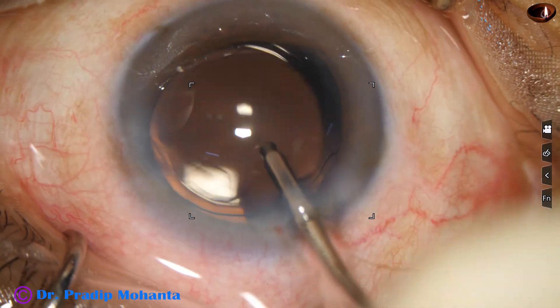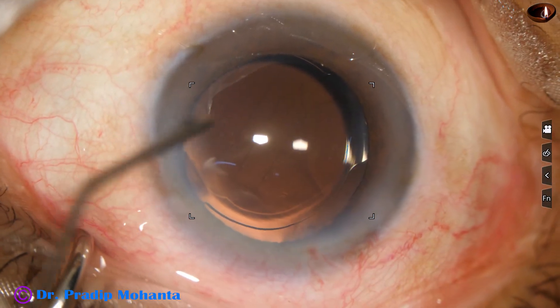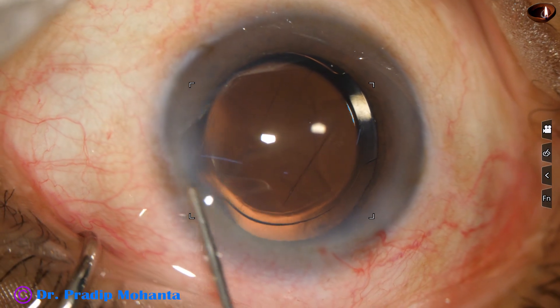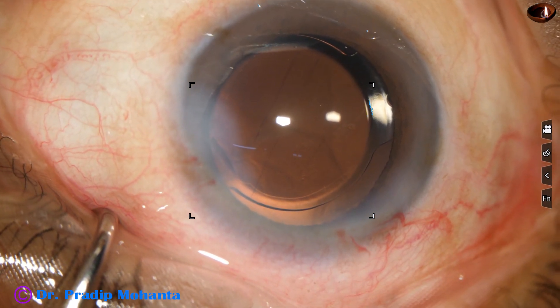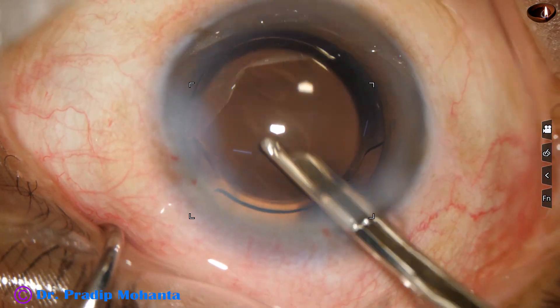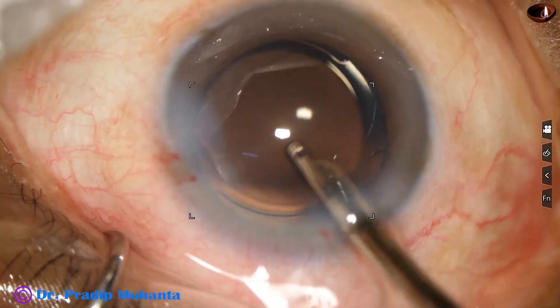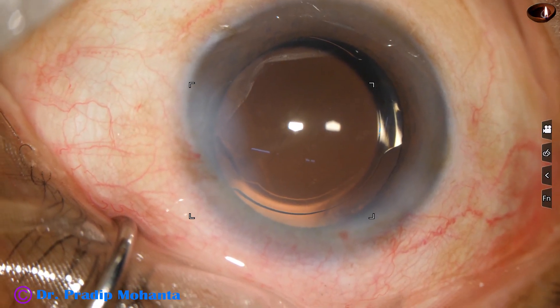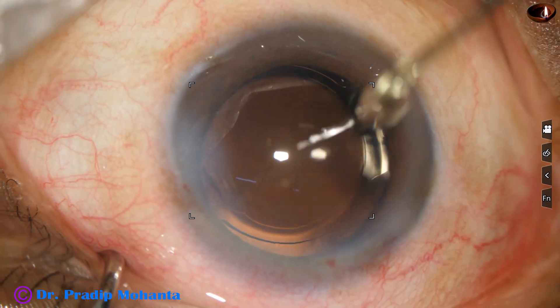And we are towards the end of the surgery. This is a totally un-edited recording, and this very hard cataract has been managed in less than 7 minutes. But we don't have to hurry up — if it comes naturally then it is okay; otherwise we can take our time with such cases. This is the final lavage of the anterior chamber. The anterior chamber has been nicely formed, and now the integrity of all the wounds is checked. A few drops of moxifloxacin are applied and the case is concluded.